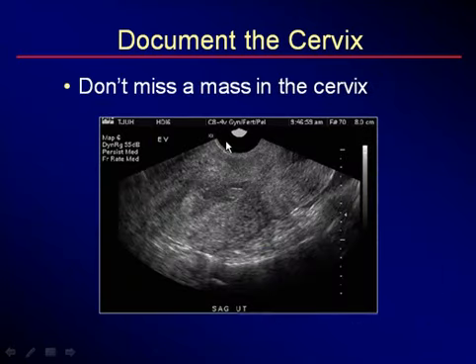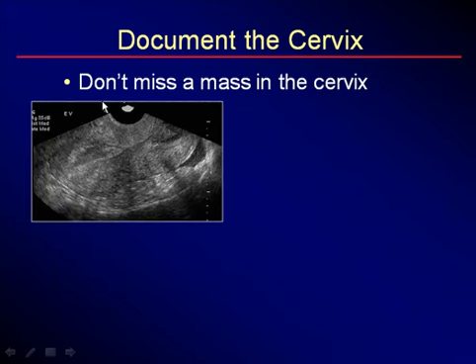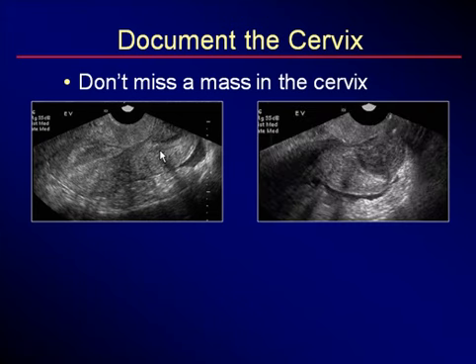This is not adequate. Such a view of the cervix where the cervix is half cut off here is not adequate. We want to be 90 degrees. Here we are a little better, but not good enough. We go completely 90 degrees and we see that there is a mass in the cervix. It's actually bulging out. The mass was here and we were only imaging a part of it because we were not seeing the complete fundus and we were not seeing the complete cervix.